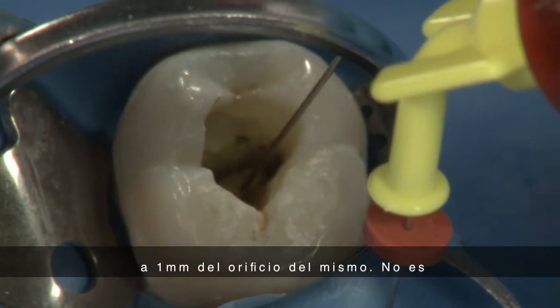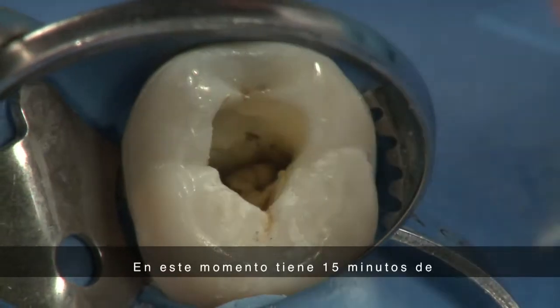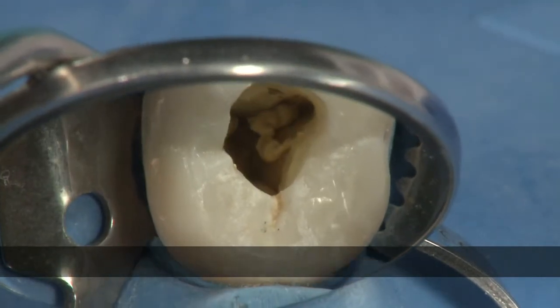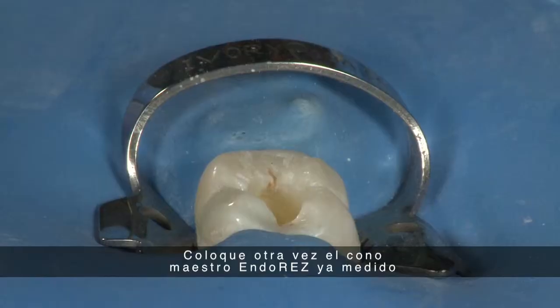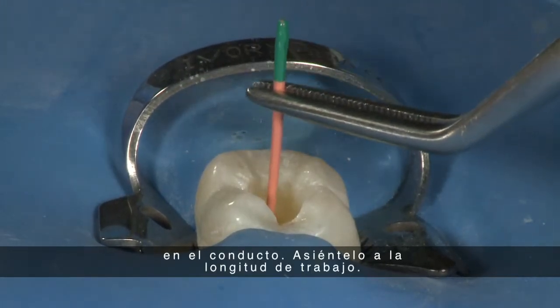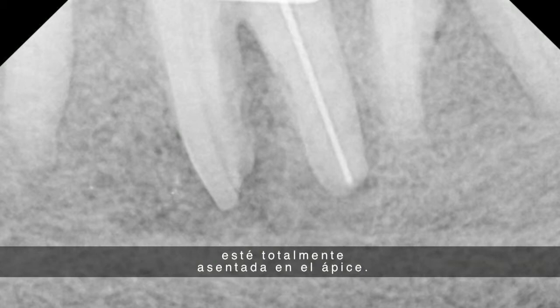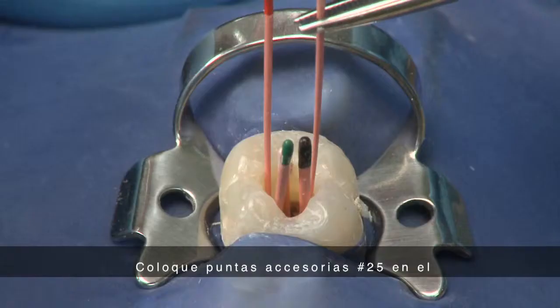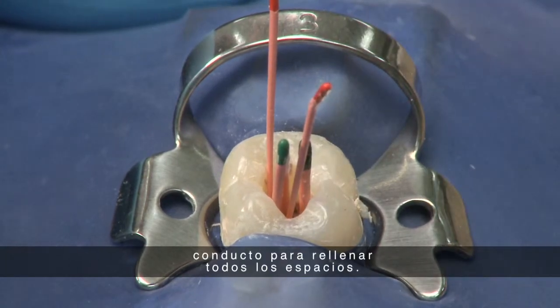There is no need to fill the pulp chamber with sealer, as cleanup will be more difficult. At this point, you have up to 15 minutes of working time before the EndoREZ begins to polymerize. Place your pre-fitted EndoREZ master cone back into the canal and set it to the working length. If necessary, use an X-ray to confirm that the EndoREZ point has been fully seated at the apex. Add additional number 25 accessory points into the canal to fill the open space.